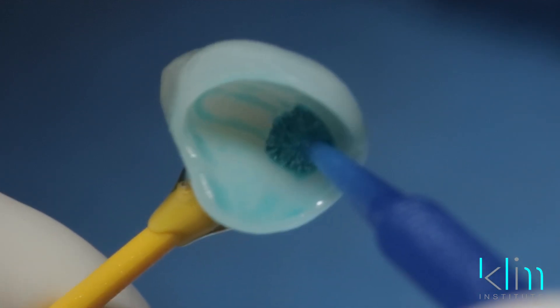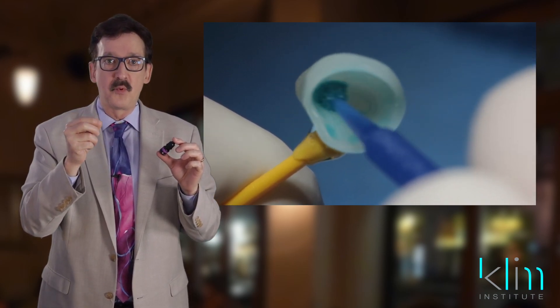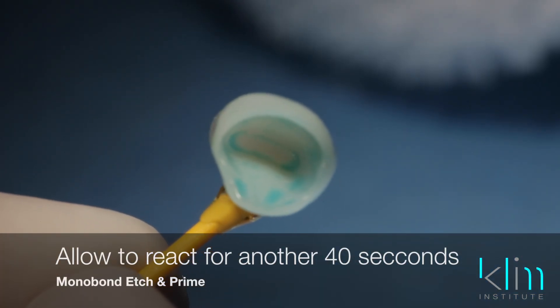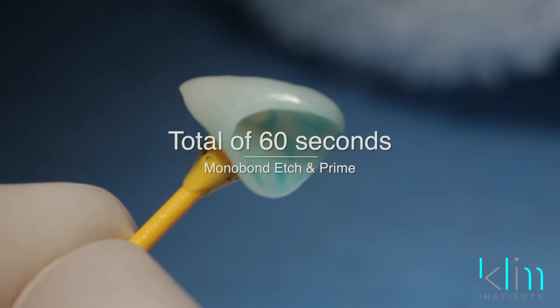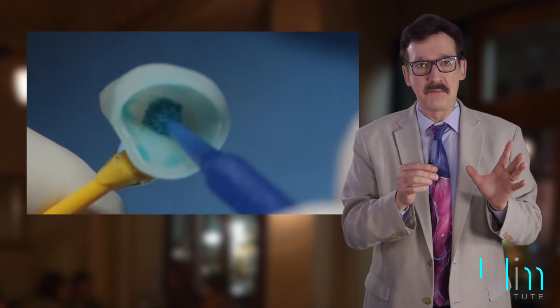The Model Bond Etching Prime liquid just on your brush will be adequate. Agitate for 20 seconds on that internal surface, then allow the Model Bond Etching Prime to dwell for another 40 seconds — so the cumulative time is 60 seconds. What's nice about this material is that it's very forgiving from a time standpoint.